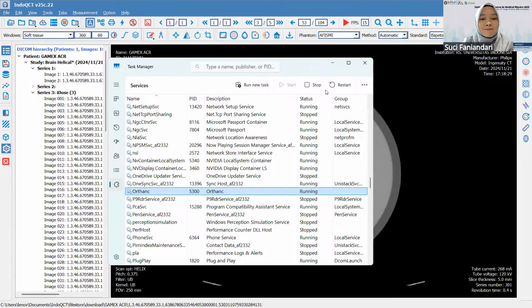Okay, so ideally, a fully operated PACS system can only give permission to a certain range of IP addresses, of course, in the local area connection, in the LAN connection.